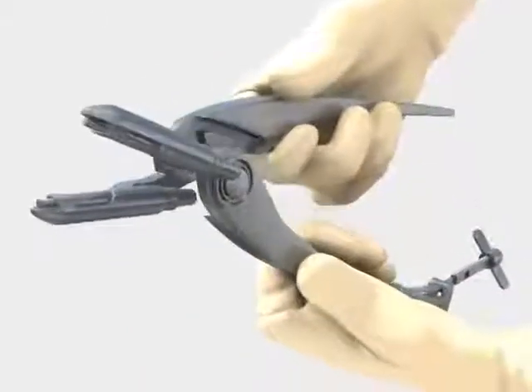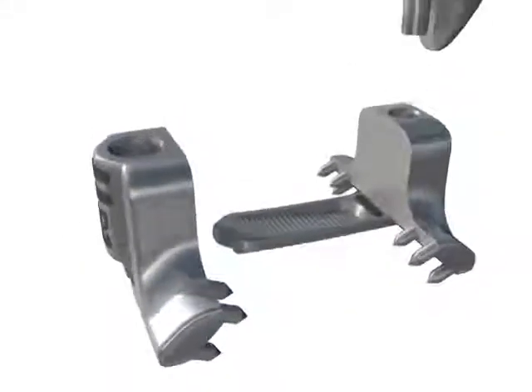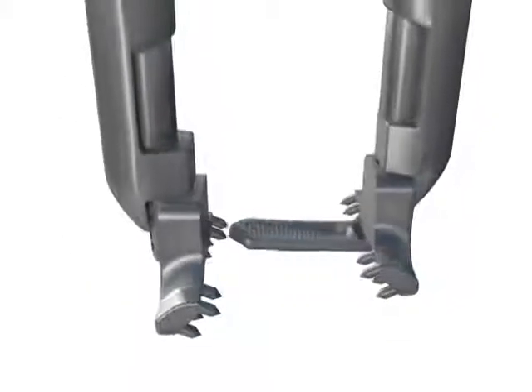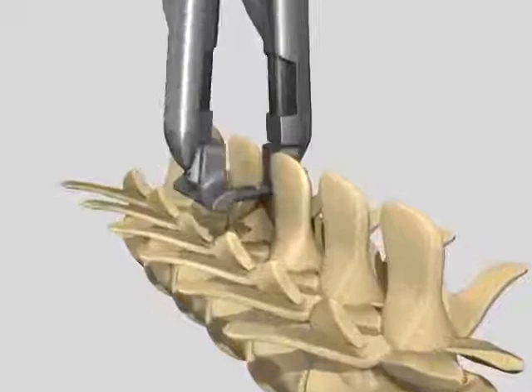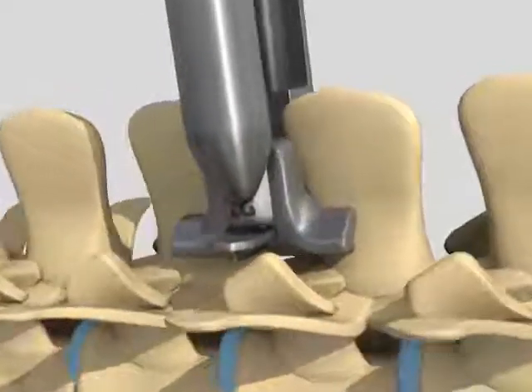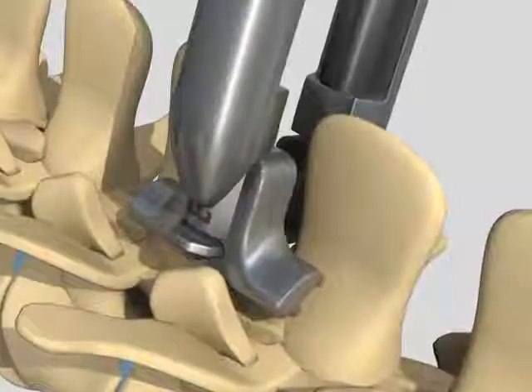The patented precision-guided Inserter Compressor is the first and only all-in-one instrument that can be separated and rejoined to ensure precise 3D alignment of the Stable Link implant every time with zero fiddle factor. This unique Inserter even allows the surgeon to quickly and accurately place the Stable Link implant with or without removal of the interspinous ligaments.